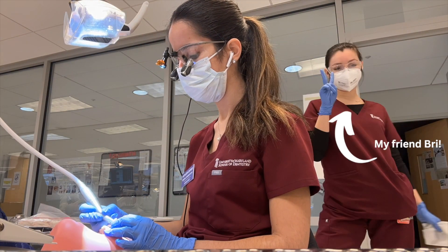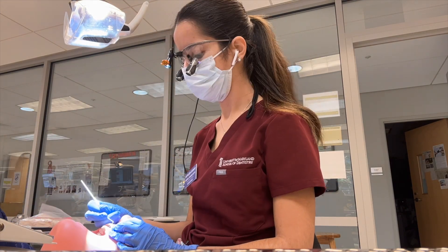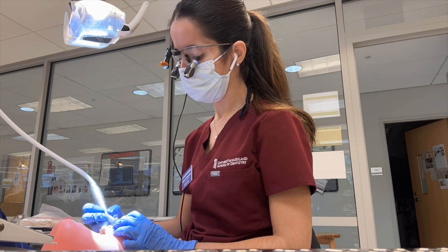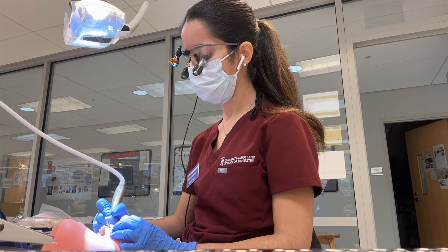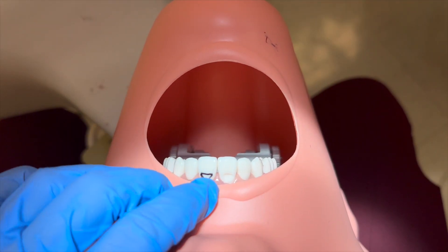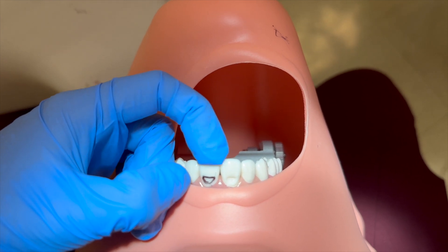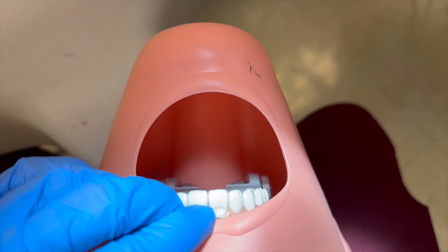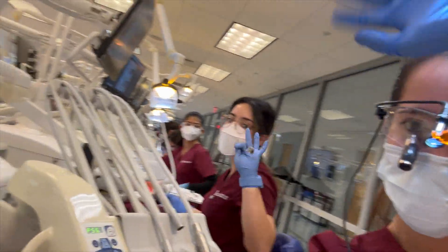Today in sim lab we were working on the maxillary arch doing Class 5 preps on anterior teeth. This was also my first time wearing loops while drilling, and let me tell you it makes a huge difference in the detail you can see and in my posture. I just finished the Class 5 prep on number eight and now I've made the outline to continue practicing on number nine. The depth and length of the prep looked good to my professor.